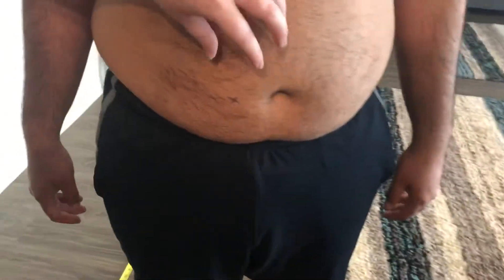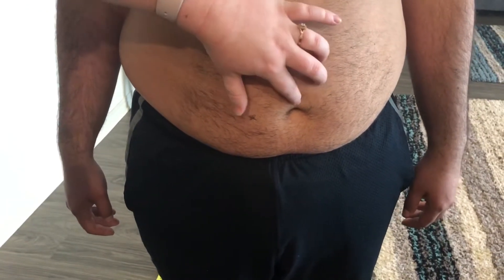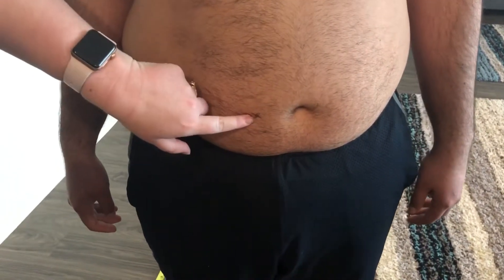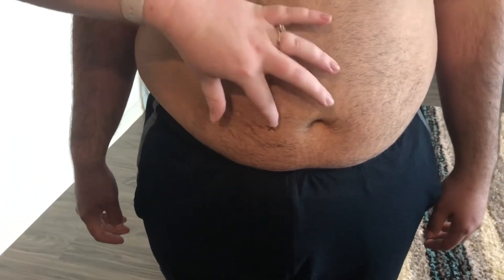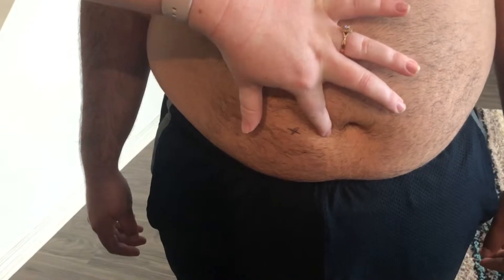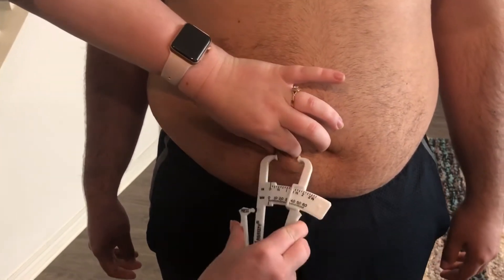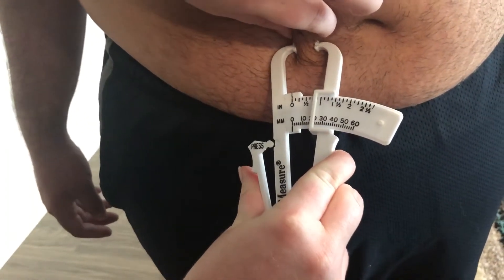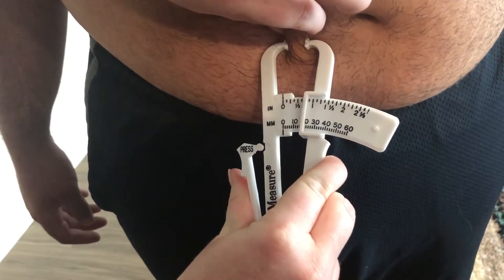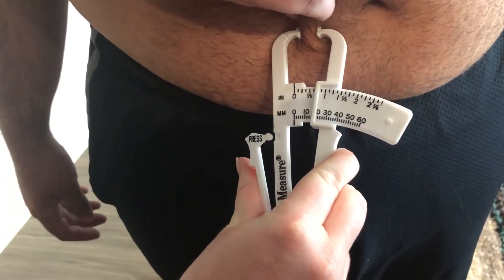Now I'm gonna go to the abdomen. You want to measure about two centimeters away from the belly button — I went ahead and marked it right there. You don't want to go inside the belly button because you don't want to cause any damage, so you're gonna go right here just outside it. Then you're gonna do another three-inch pinch and pull, and that measurement is about right at the 20 millimeter mark.